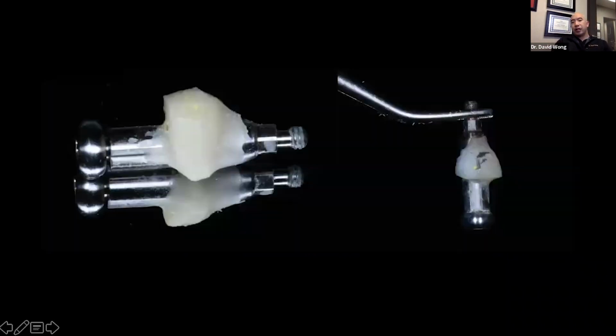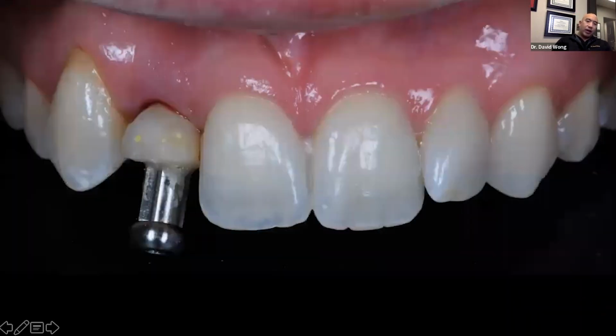You're going to cure it, and then you're going to take it off. And then you're going to mark which side was the facial. That way, if you're a specialist, your restorative dentist knows how to orient it. If you're restoring your own, that way you don't get lost. But this is the custom impression coping.